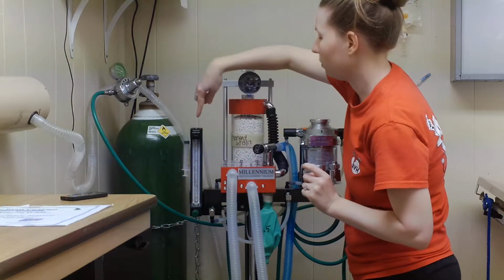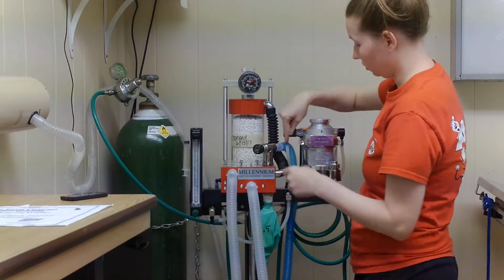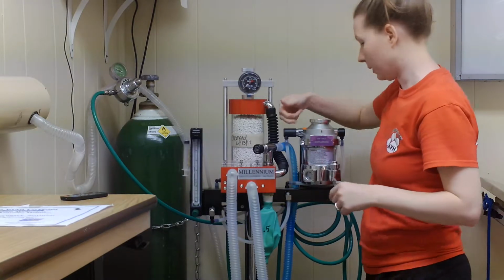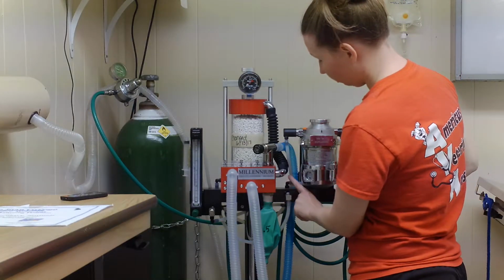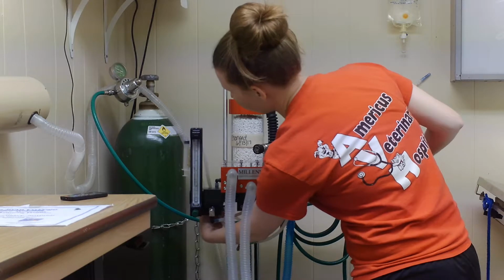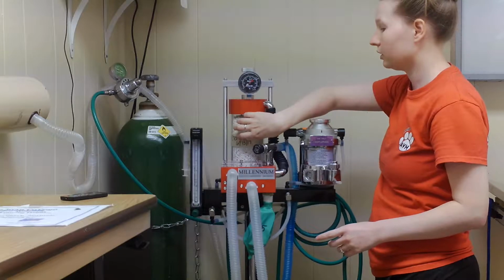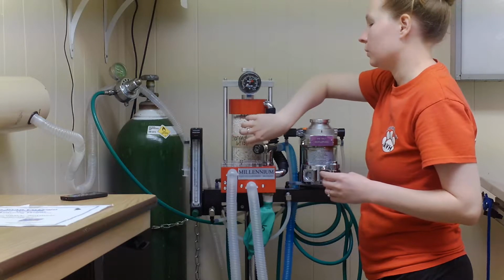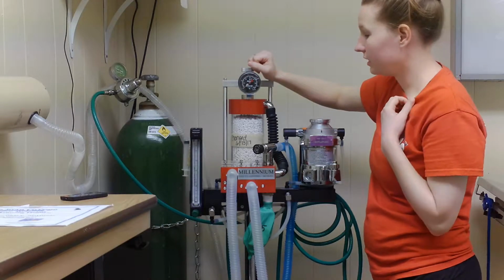The oxygen will come through the back of this flow meter, and you can just follow it to the vaporizer, which we use isoflurane. It goes from the vaporizer, and you see that it says inlet and then outlet. From the outlet, you can follow it through this little hose back here, which comes through to the side over here through our soda, which absorbs a lot of the carbon dioxide that is emitted from our patient.